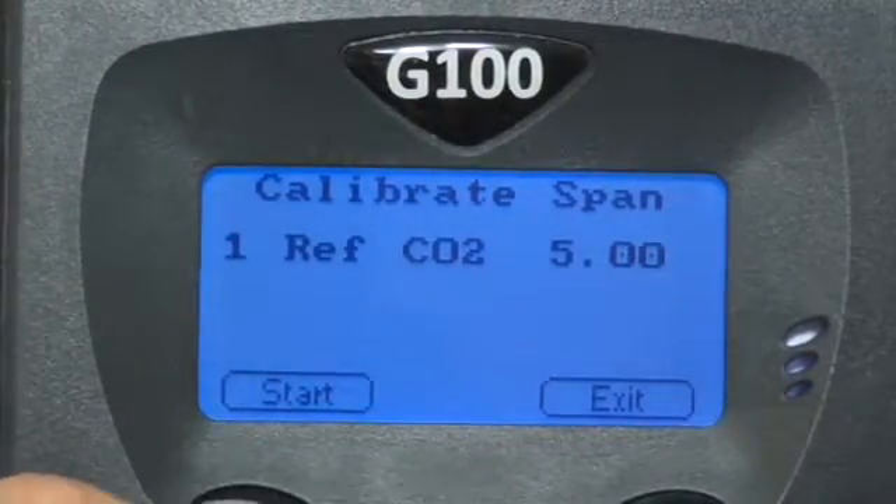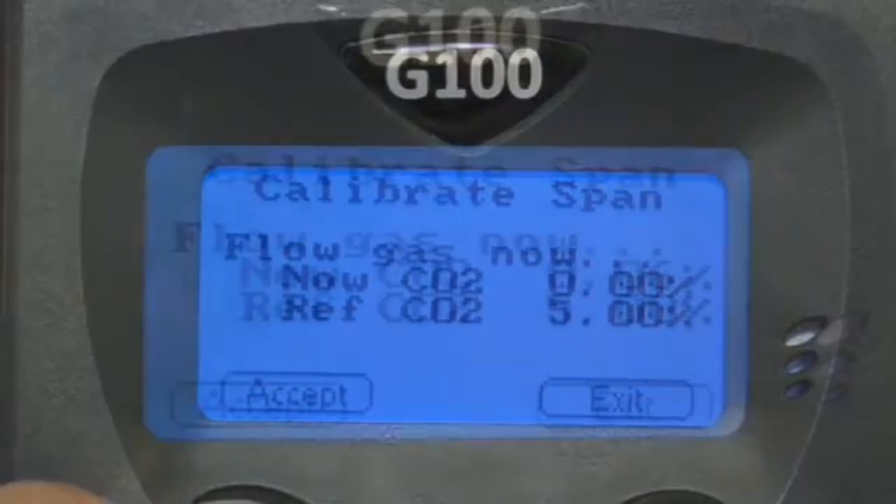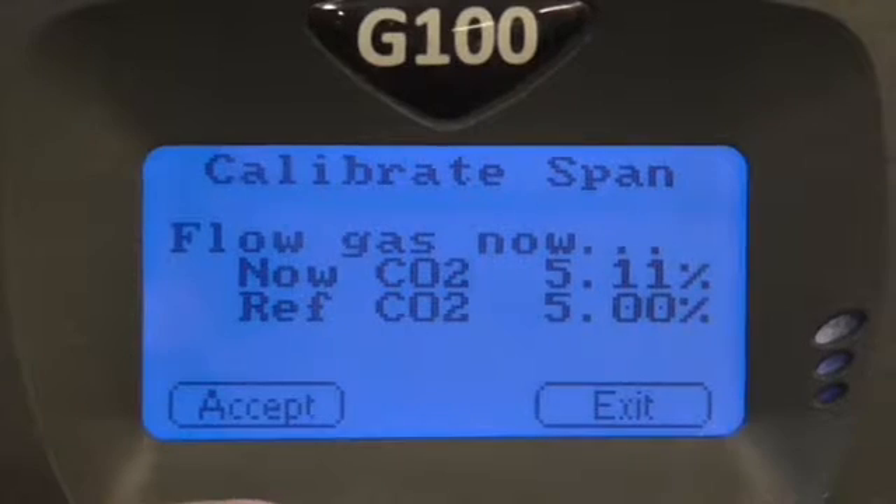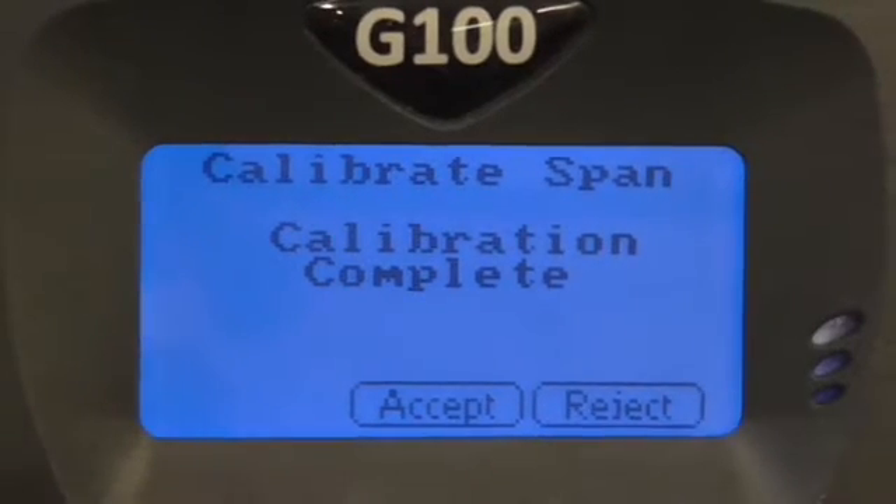You will now see a NOW CO2 reading and a REF CO2 reading. If done correctly, the NOW CO2 value should be rising to your REF gas value, which was previously entered. We recommend leaving this for at least 3 minutes or however long until the gas stabilises. Once stable, press accept and you should see a calibration completed message.